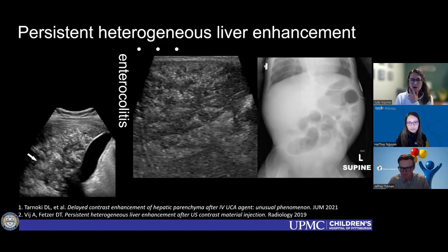For brain imaging, we will compare relative enhancement for different regions of the brain, like the deep gray nuclei versus the supratentorial white matter, just on the same image. But again, that's a relative enhancement, not an absolute number.